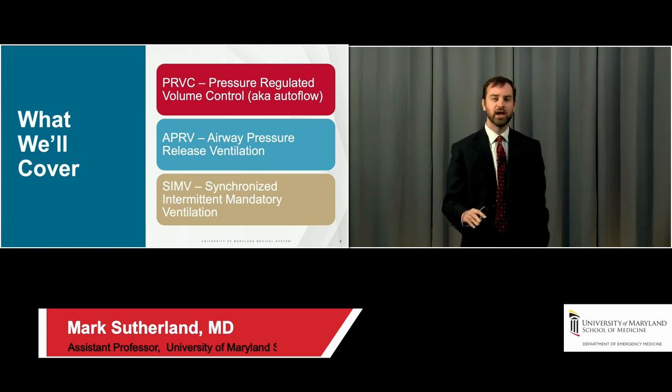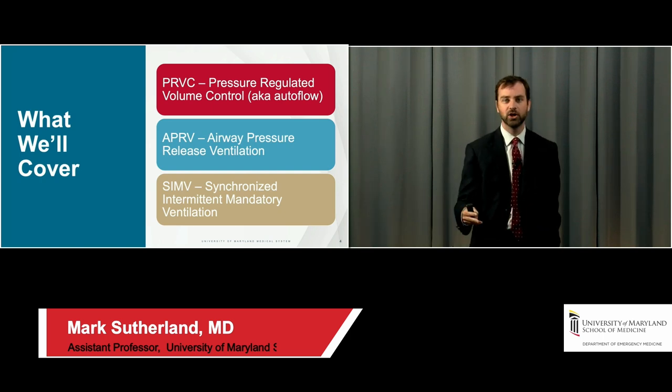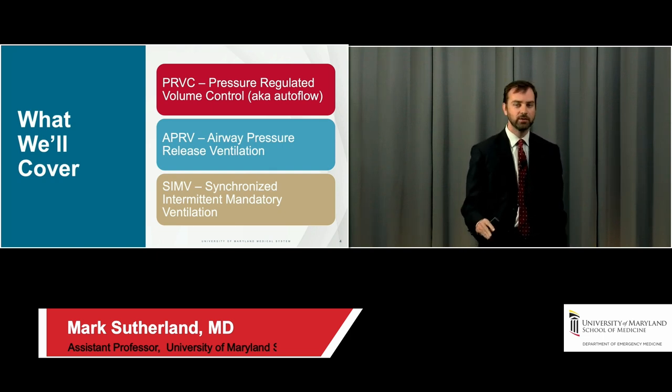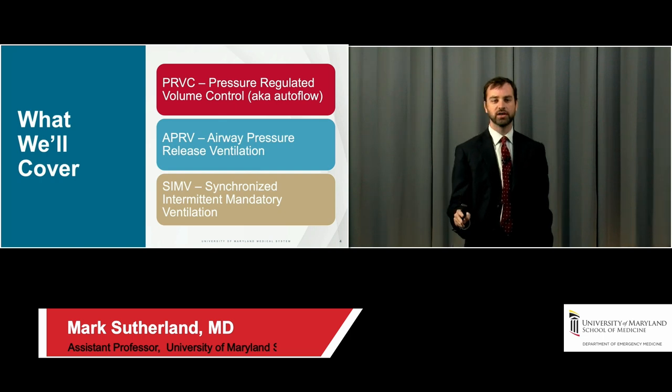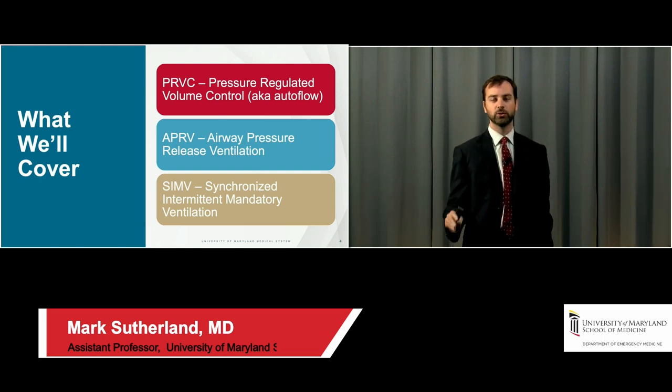So I would argue, actually, at least at our shop, I can't speak for too many other places, but at University of Maryland, if you're familiar with those four basic modes from the original table, PRVC, APRV, and SIMV, probably 99% of the time when you walk into the room of an intubated patient anywhere in our hospital, you will be familiar with the mode they're on.